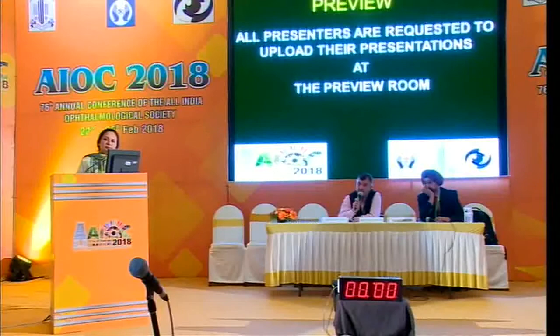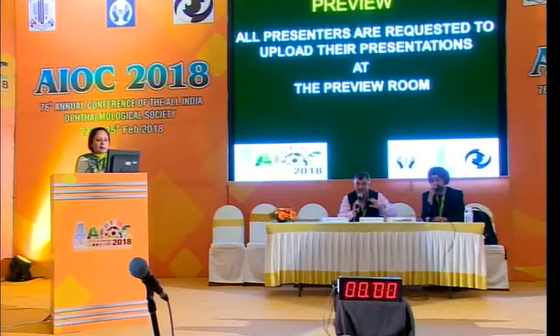I think the best is you just keep on doing OCT, maybe at 2 or 3 weeks. We have these cases where this tractional retinal detachment was so bad, like everything pulled up. Otherwise it takes a few months for it to go back. But you will keep on seeing every time that it is going back. And finally, it will get back, and they will get much better vision also.